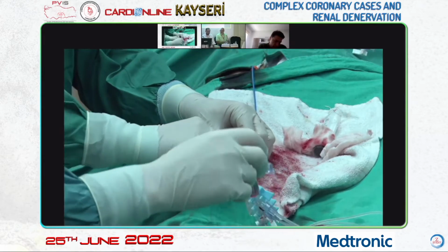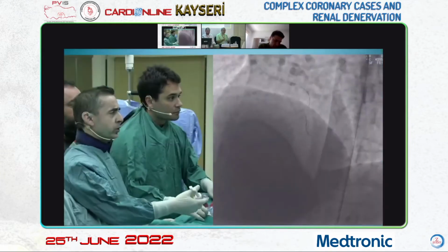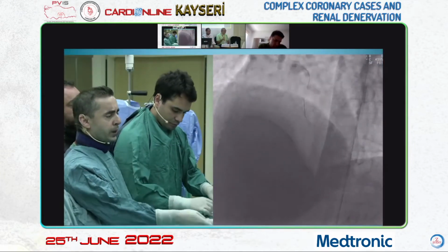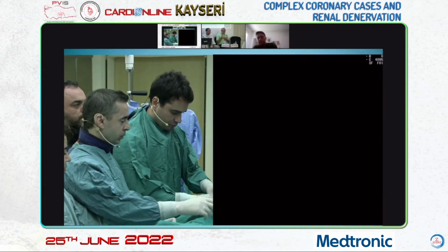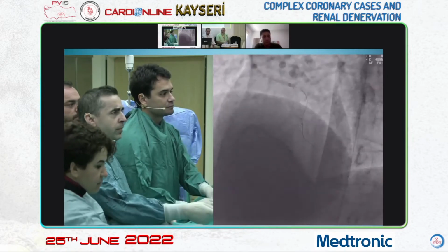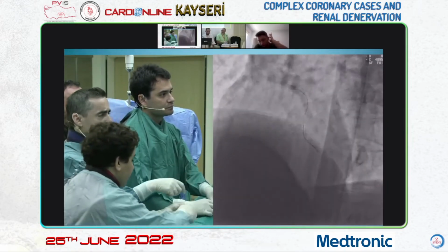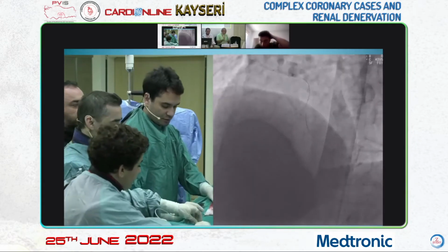So trying one and exchanging it would be a consumption. It's related to our practice, and everyone uses a different wire. Sometimes we try one and then pass to another. And Nihat is very experienced here.